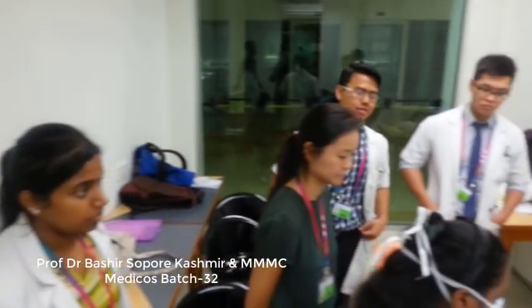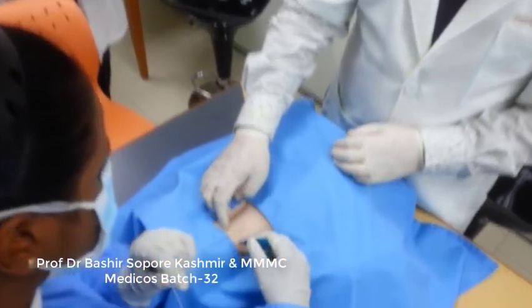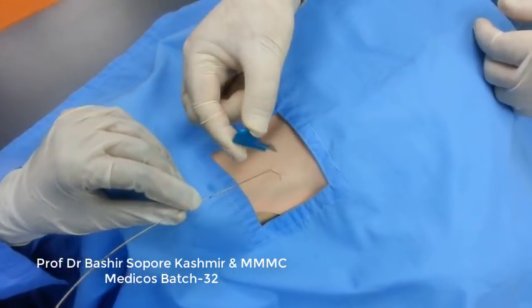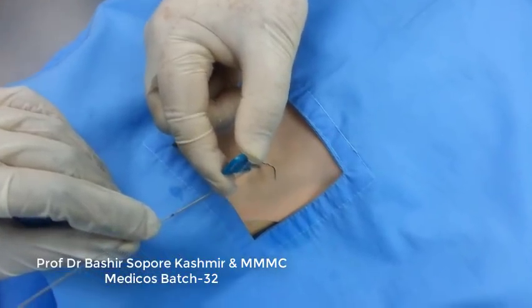We take an 11 blade scalpel and we give a nick by the side, like this. So the nick is to be given. I can show that we take the scalpel like this and we give a nick like this. You got my point?